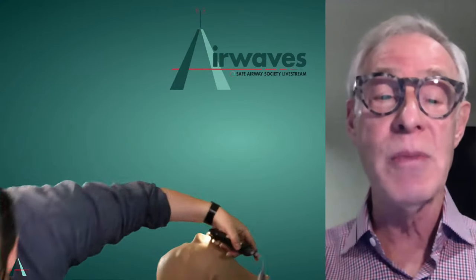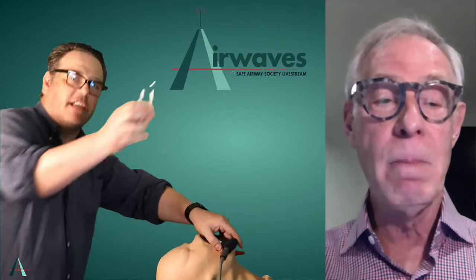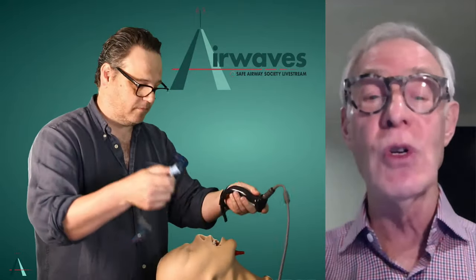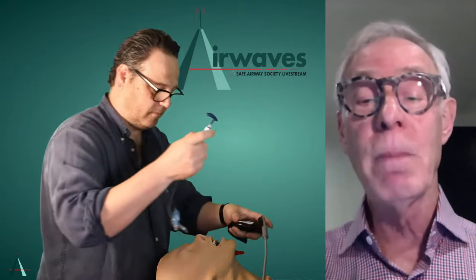Yeah. And then there was a report of a blade, a stat blade, and the stat blades are not as robust as the current blades. So that's one of the older traditional GlideScope blades. The blade broke, and I'd also be concerned about the potential for dental injury. So the suggestion I'm going to make, rather than changing the angle of the blade, is insertion of the endotracheal tube first under visual control.